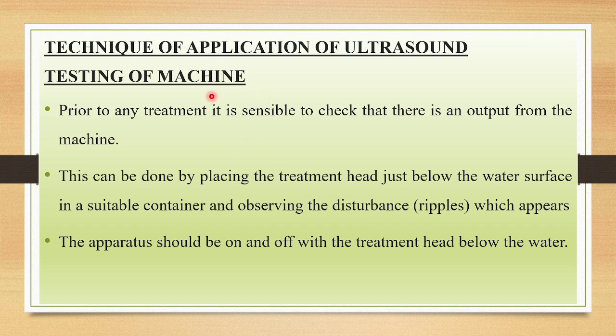So coming to the technique of application of ultrasound. First, before going for the treatment procedures, we will be using a self-testing procedure. How will we test whether this ultrasound is working or not? That can be found by testing these machines. Prior to any treatment, it is sensible to check that there is an output from the machine.